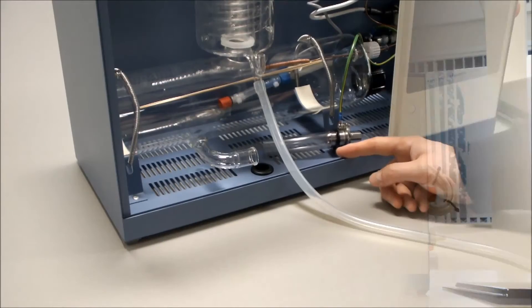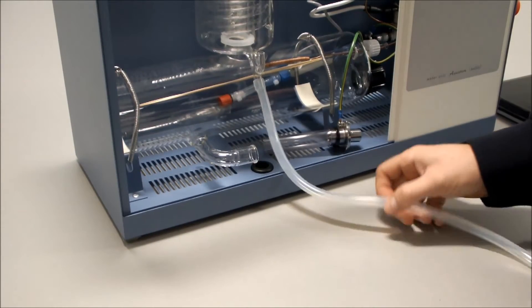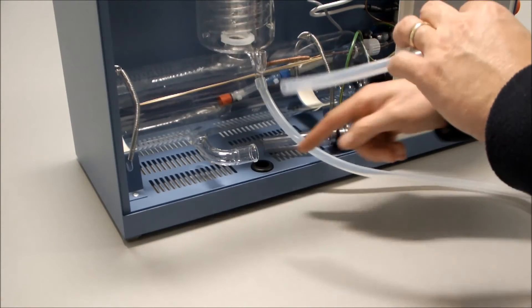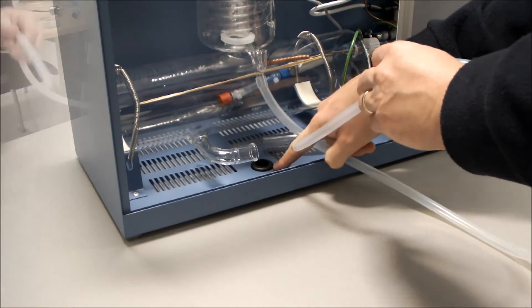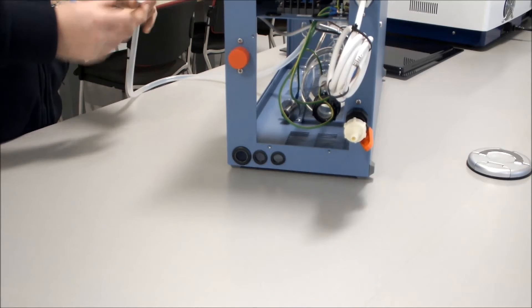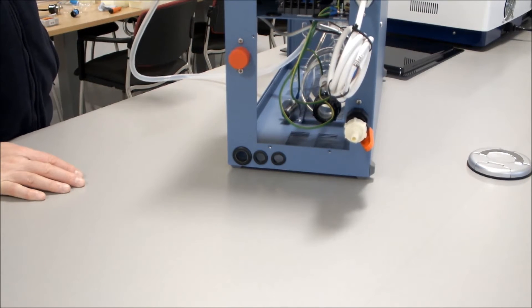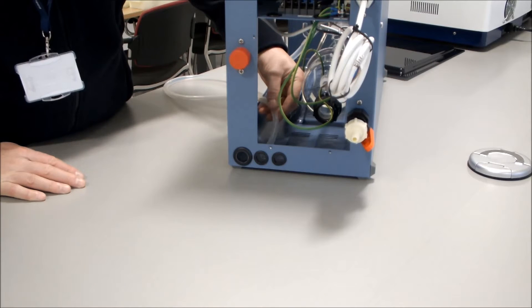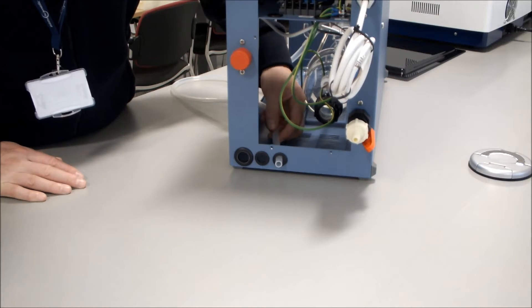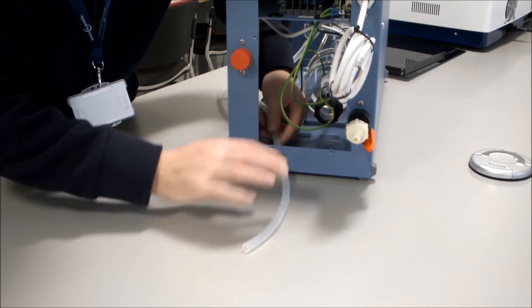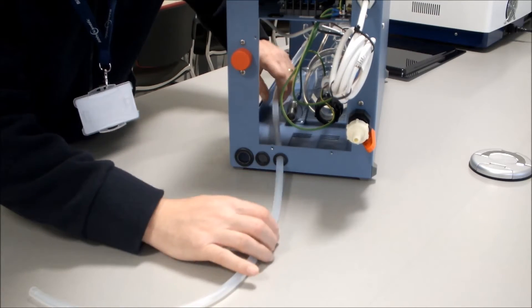If the unit is to be wall mounted then the distillate output tube can be fitted through the hole at the bottom. If the unit is to be bench mounted then the tubing can be fed from the inside to out through either of the two small holes. For this demonstration I will put it into the furthest of the three holes.